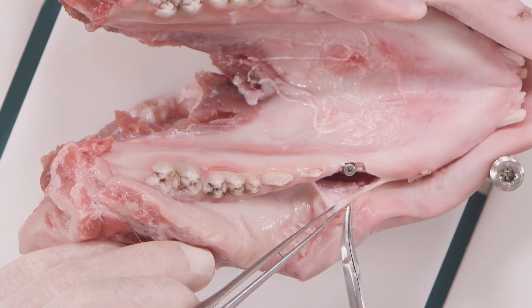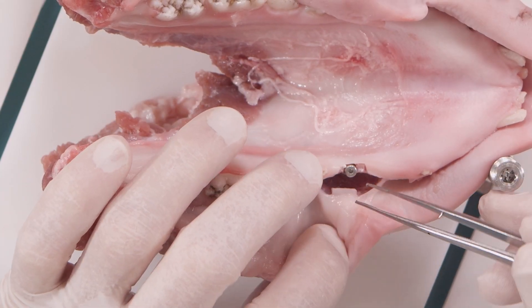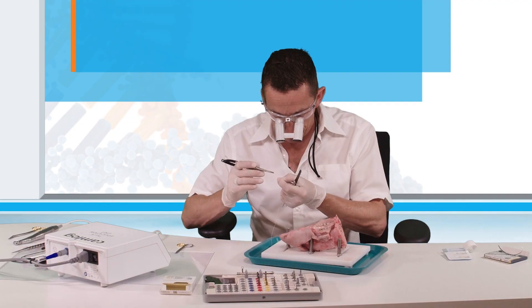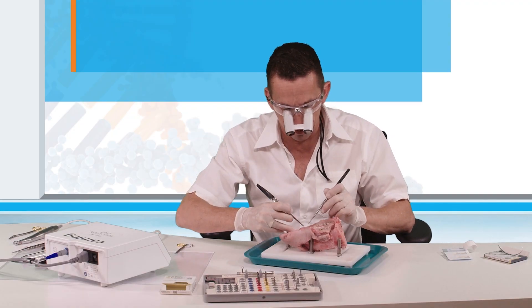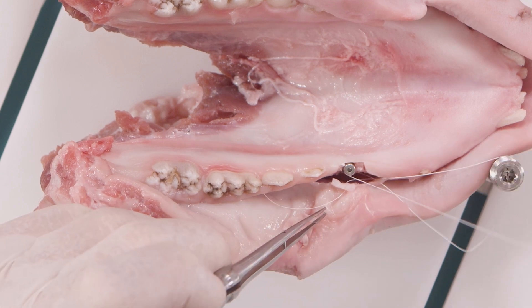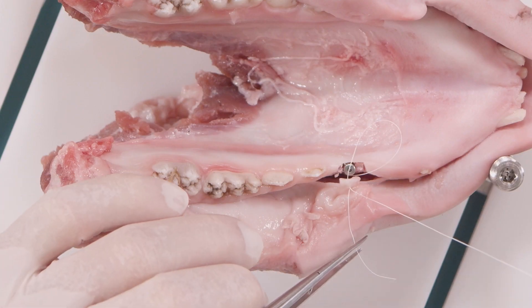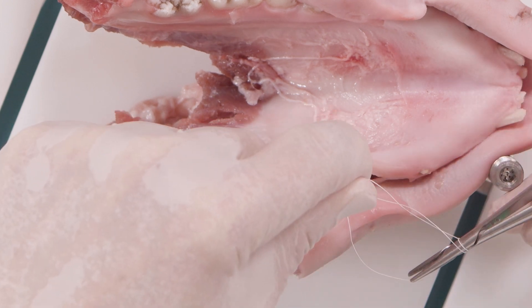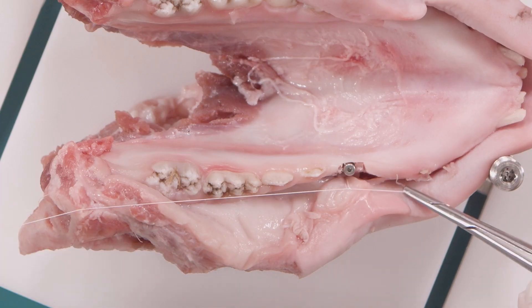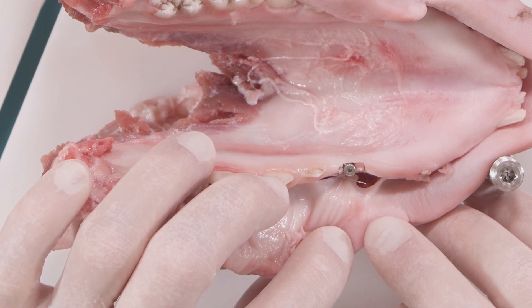The next step is suturing. We remove the holding suture and now we place the flap in a more apical position. We stitch from the outside through the keratinized part of the flap, a little more apical than before. We go through the periosteum, which still is on the bone on the buccal side. By tying the knot, you will see that the flap is moving to a more apical position. Now you see the flap is positioned more apically — the same we do left and right.